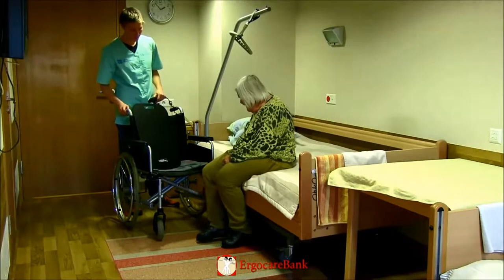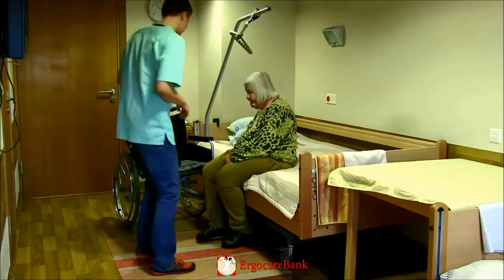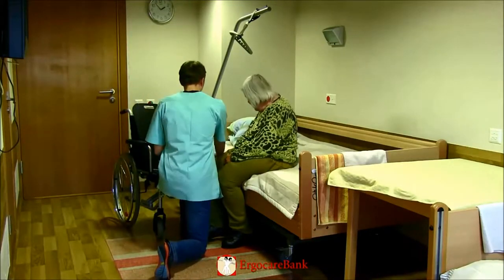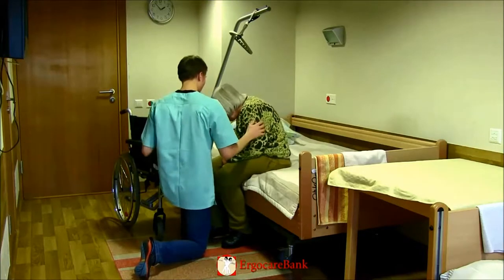He removes the closest armrest of the chair and asks Christina to lean away from the wheelchair so that he can place the slide board partly under her buttock.